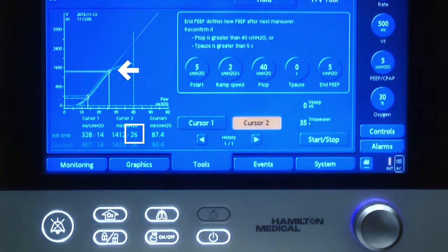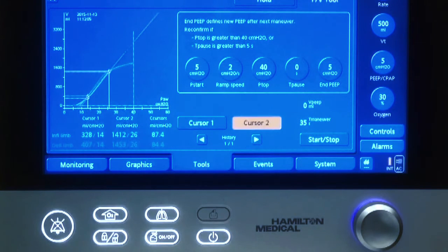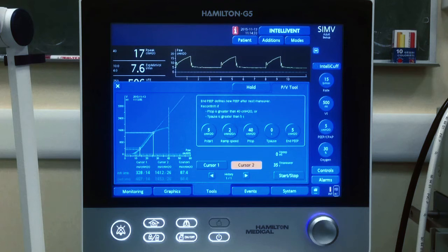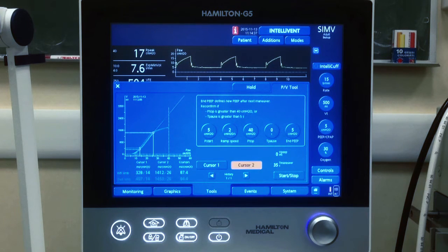So with this tool we would choose a PEEP higher than the lower inflection point in order to keep open the recruited areas, and a plateau pressure lower than the upper inflection point to avoid overdistension. To be continued.